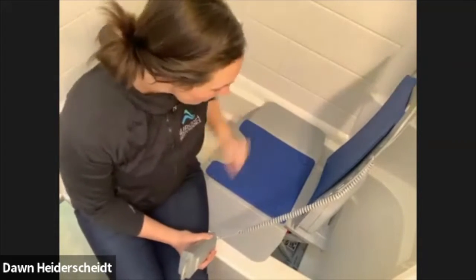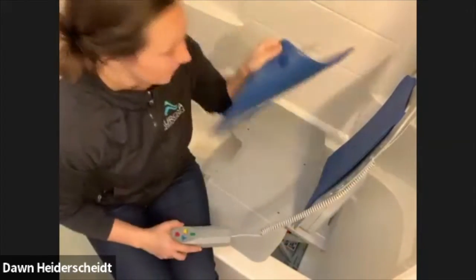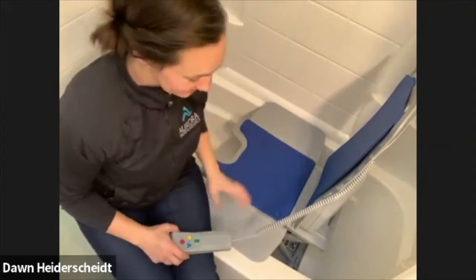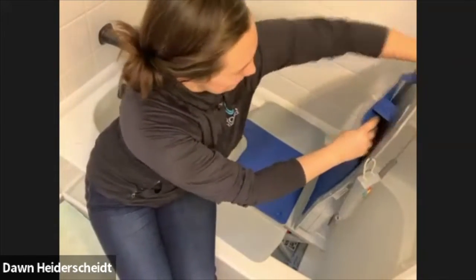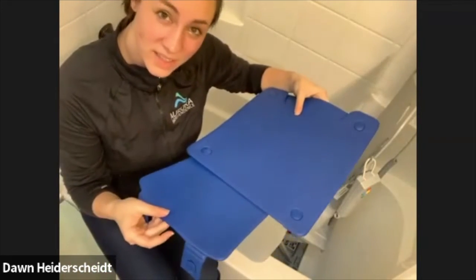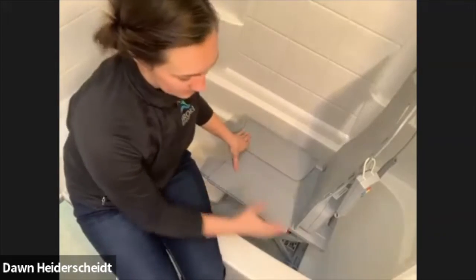I will also say, for cleaning purposes, these literally just pop right off. It's a tiny little connection that goes right into the hole, so you can take those on and off really easily. They do say to avoid heavy Clorox and chlorine-based cleaners — you want to use light, mild soap. You can take off these pieces and wipe down your seat, then fold in the flaps here.